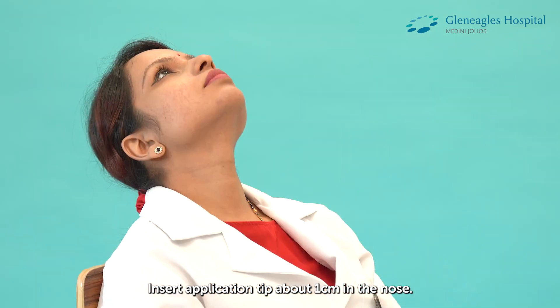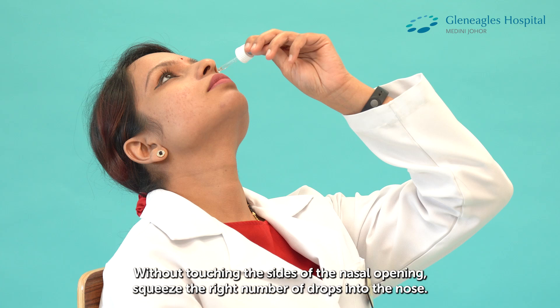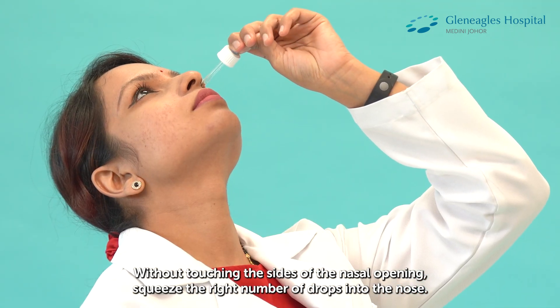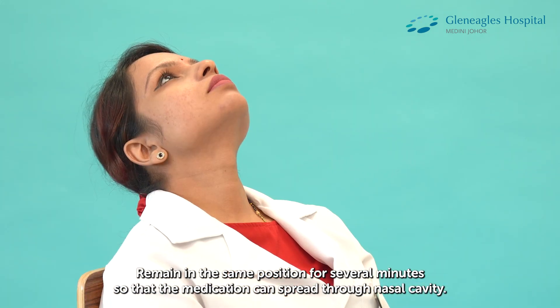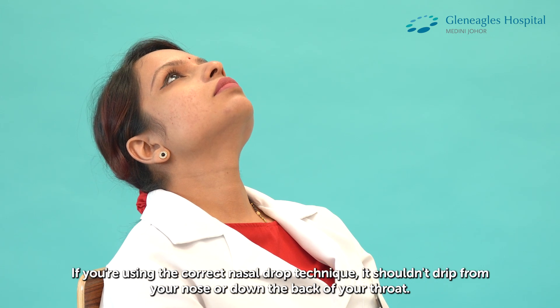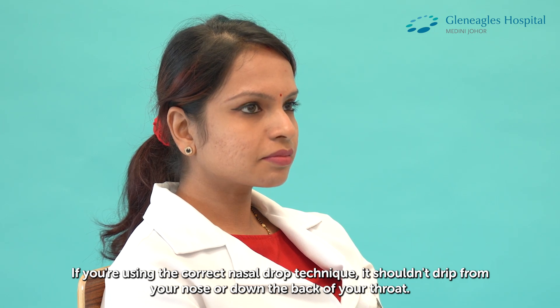Insert the application tip about one centimeter in the nose. Without touching the sides of the nasal opening, squeeze the right amount of drops into the nose. Remain in the same position for several minutes so that the medication can spread throughout the nasal cavity. If you're using the correct Nasal Drop technique, it shouldn't drip from your nose or down the back of your throat.